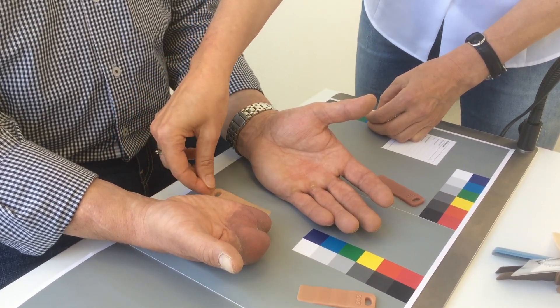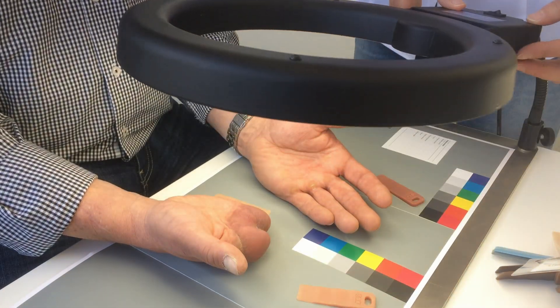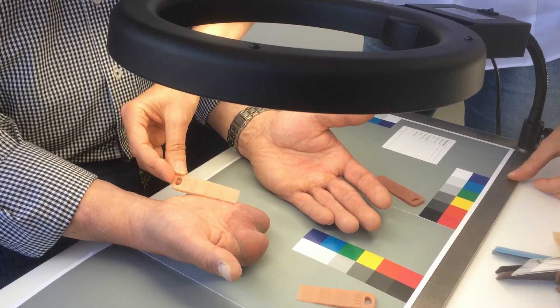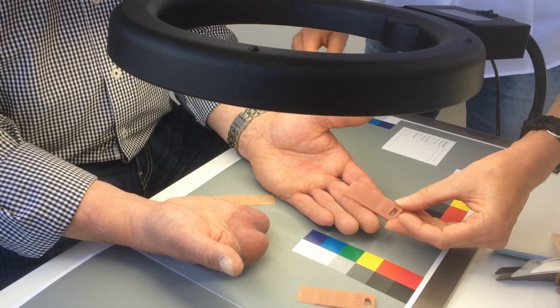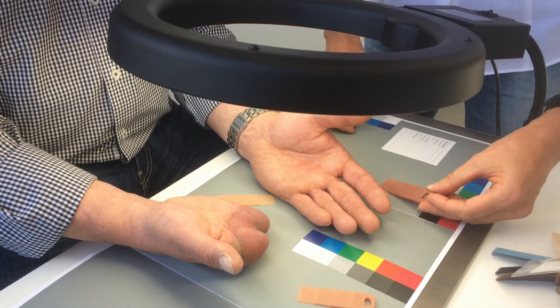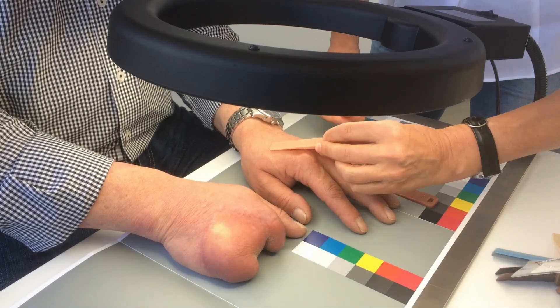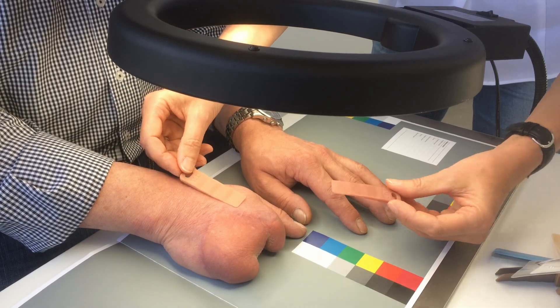To double-check the entire selection, I use the circular lamp to compare colors. The light palm of the hand and the character skin tone for the fingertips are consistent. Please turn your hands down. The base tone on the back of the hand and the affected side match the character color for the joints and the back of the hand.